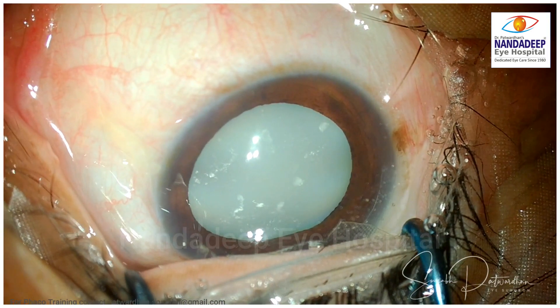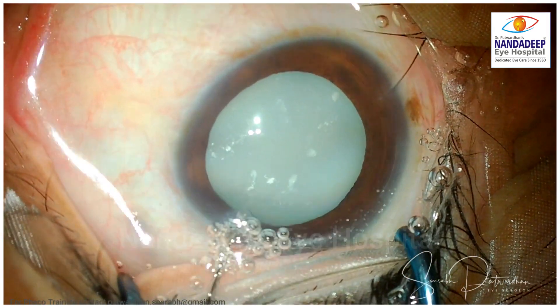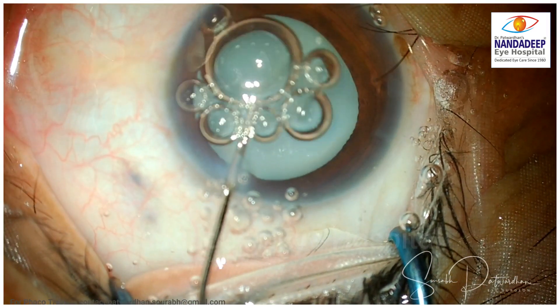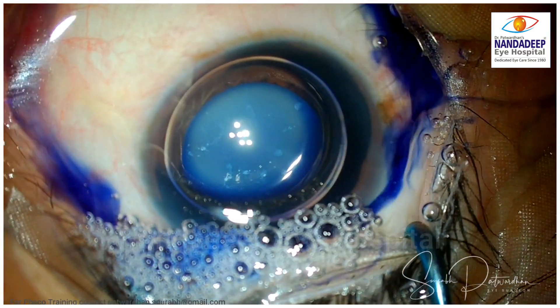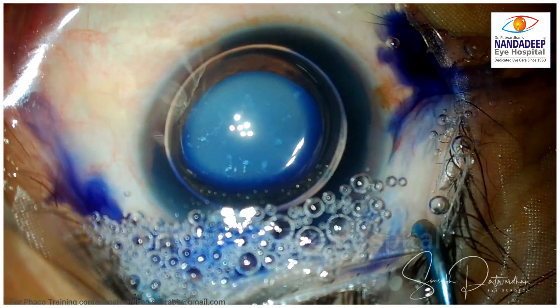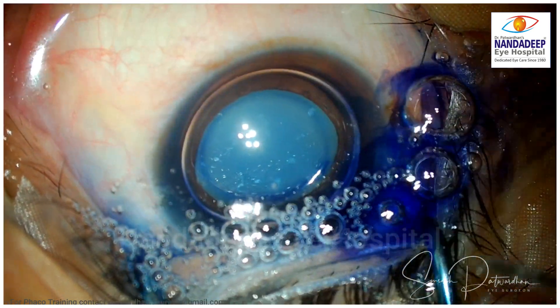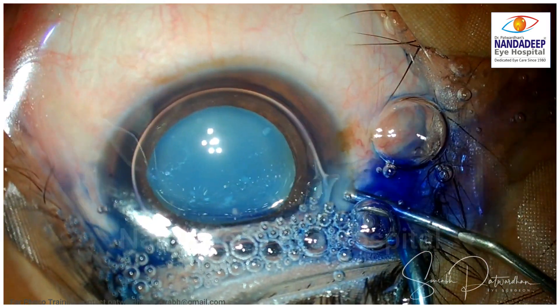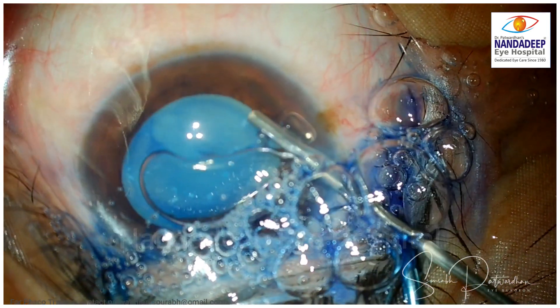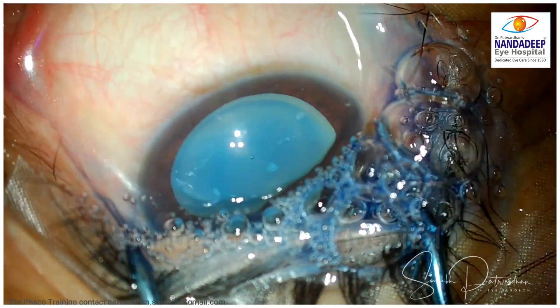There goes the incision — it is a 2.8 mm incision. It is better to hold the globe, but here the patient is moving the eye away from the incision. So I use that movement of the patient's eye as the counter traction for creating the incision. Staining of the capsule is a must, so I stain under the air always and keep the dye there for at least 15 to 20 seconds, so you get nice adequate staining for better visualization during the procedure.